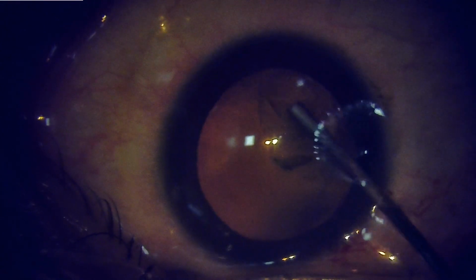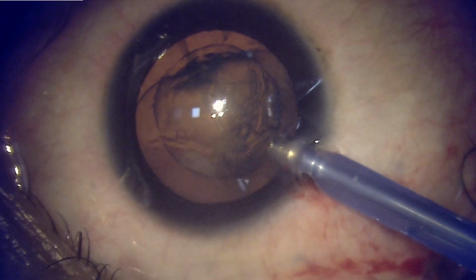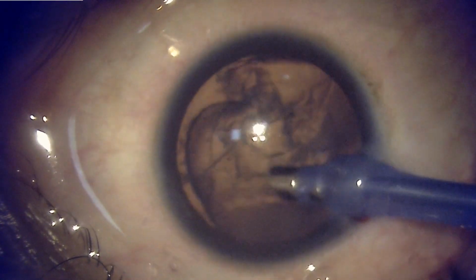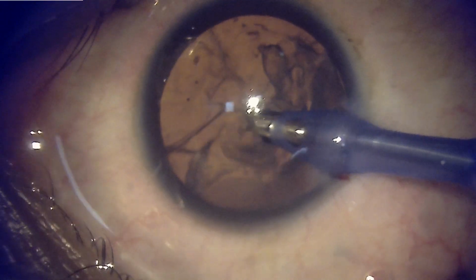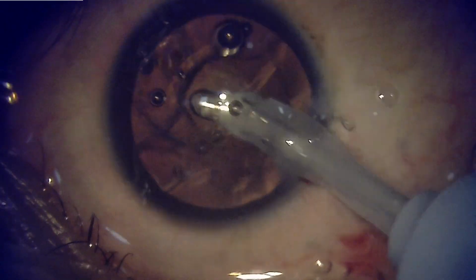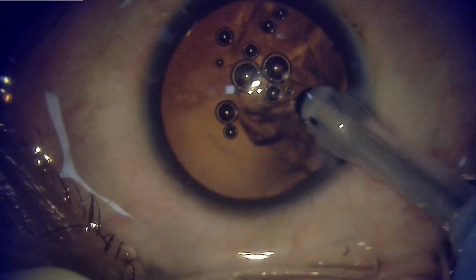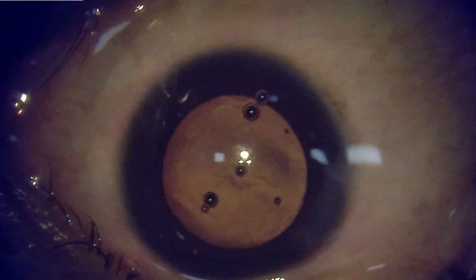However, once you do hydrodissection, then you can ramp up the light, because now the lens becomes opaque and these patients are relatively comfortable. And more so, if you ramp up the light, you can actually control the whole scenario with the phaco probe. So even if the patient is not cooperative, you can actually do your surgery. You don't need a side port because these are all very soft cataracts. There's no need for any nuclear disassembly, and the bulk of the lens matter is gone. There's hardly any nucleus, and then you switch to the irrigation aspiration cannula to remove the finer filaments of the lens cortex.